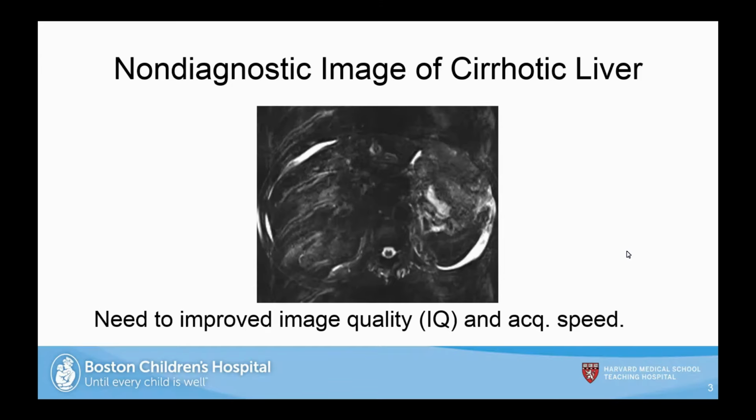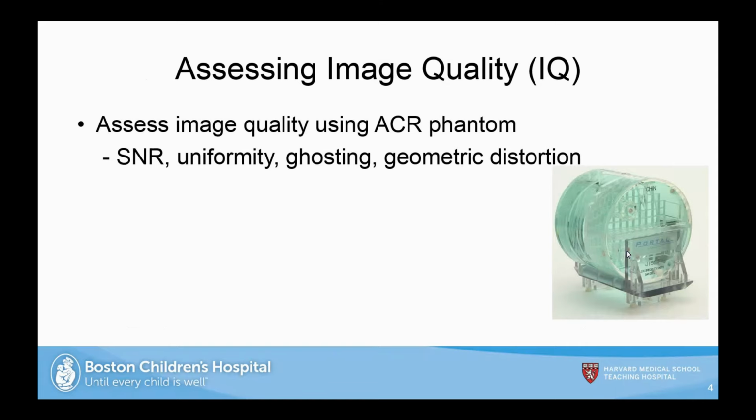Okay. Because they want to be able to do it in real time. But in real time, that means not in image space. Right. Like in k-space. So you're actually monitoring k-space to find it. Okay. Yep. Interesting. They didn't mention that, but yeah, that's right.